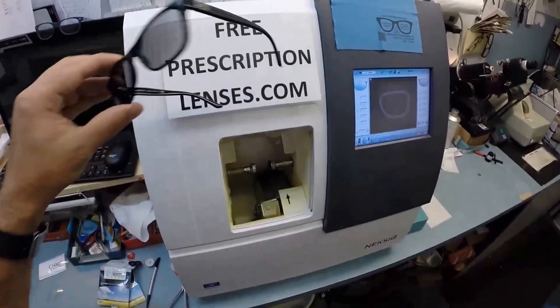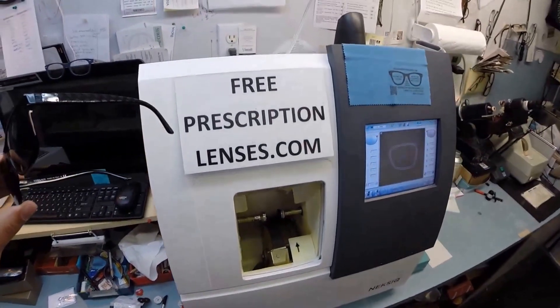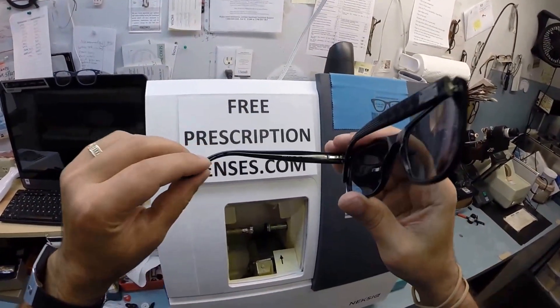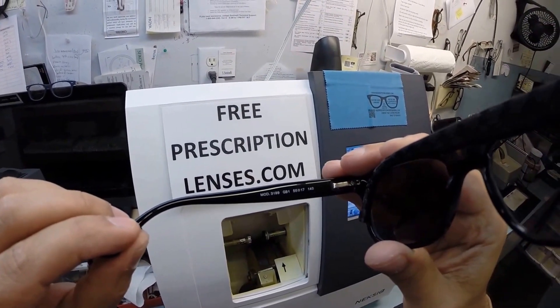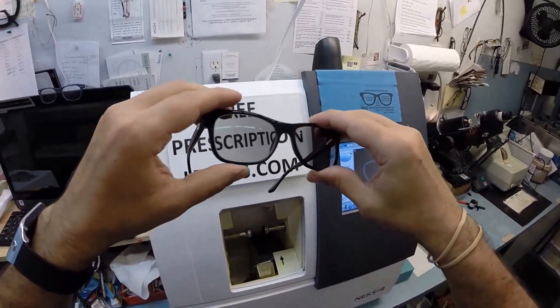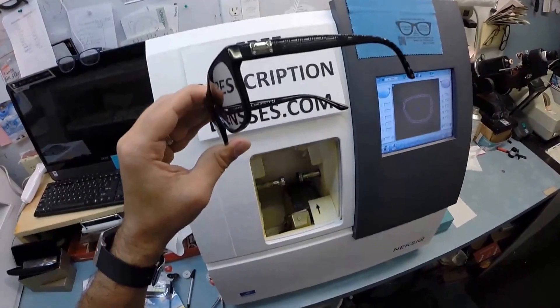That's that. If anyone has any questions, you can email me at freeprescriptionlenses@gmail.com, or simply click the Contact Me button on the website. Reed in Sanford, North Carolina, I hope you enjoyed watching as I cut prescription lenses for your Versace 3199 color GB1 in the 55 eye size with the 17 bridge. And everyone else got the chance to see how I bring that love and feeling back to glasses. Thank you.